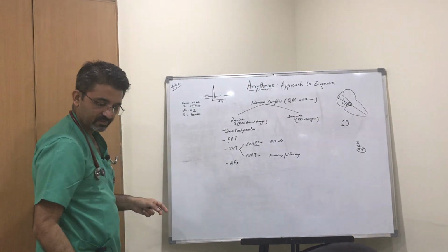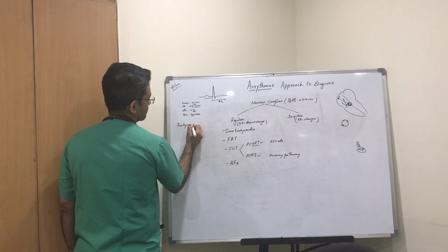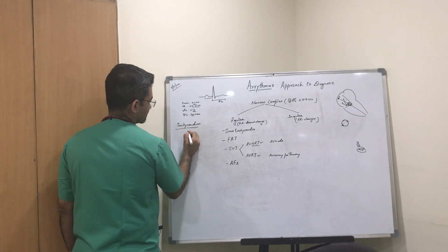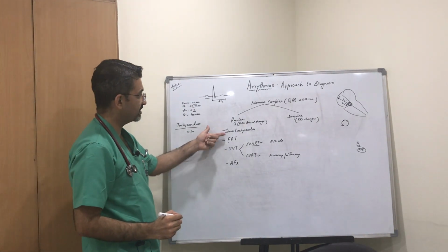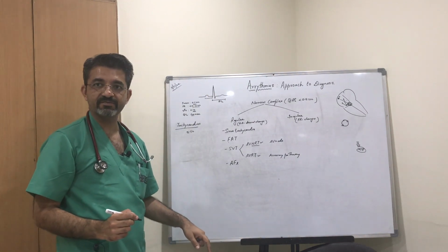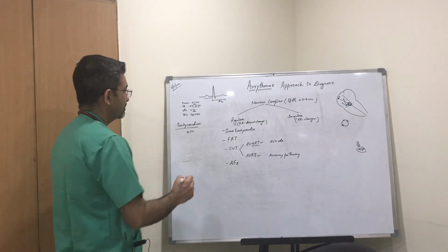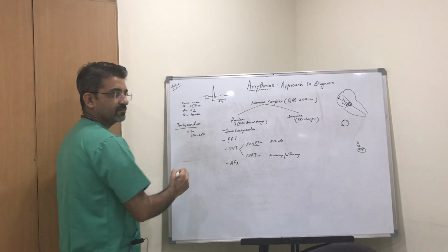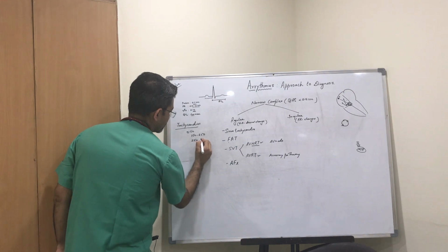You know, simple tachycardias, which can be sinus tachycardia, generally the heart rate doesn't cross 150, right? But when we talk of tachycardias apart from sinus tachycardia, say for example SVT or focal atrial tachycardia, the rate can be somewhere between 150 to 250. If we are talking of flutter, the rate could be between 250 to 350.